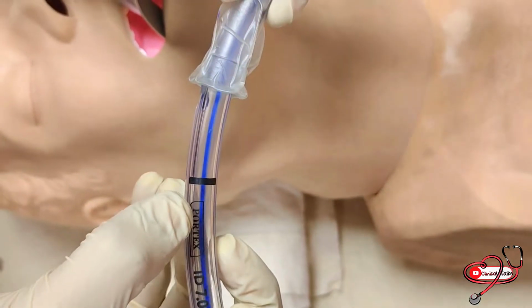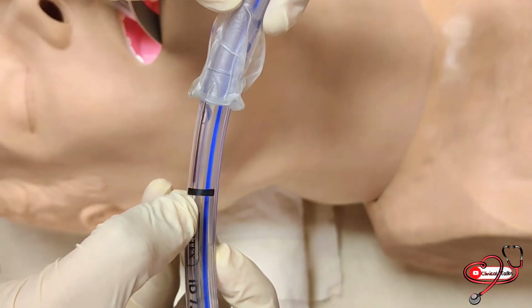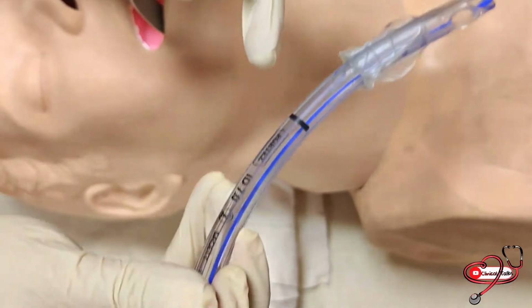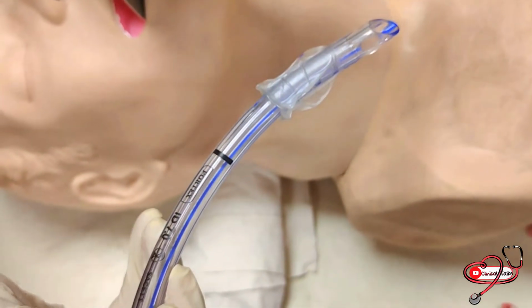There is one black mark on the endotracheal tube. When you insert the endotracheal tube into the trachea, see to it that this black mark goes beyond the vocal cord.